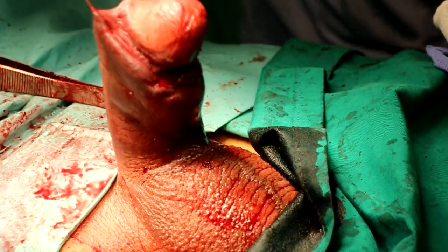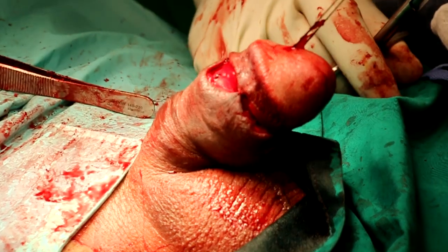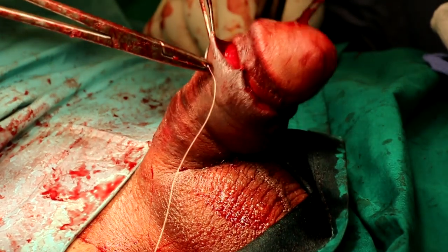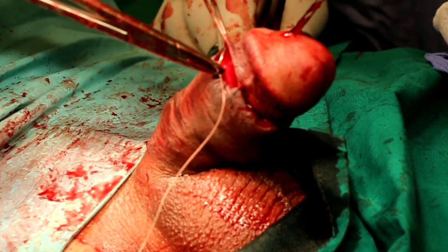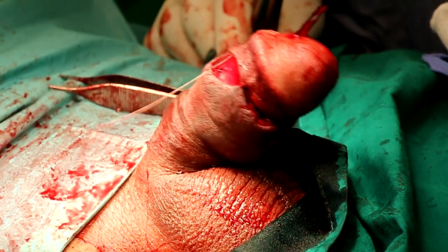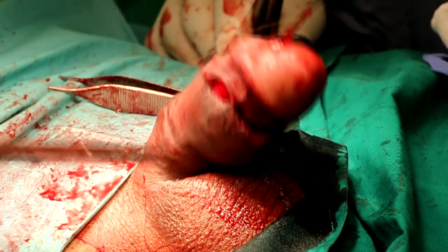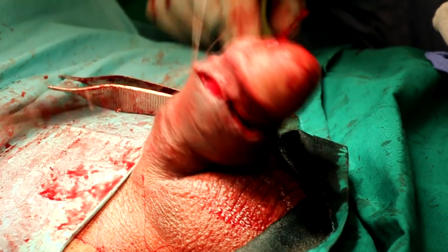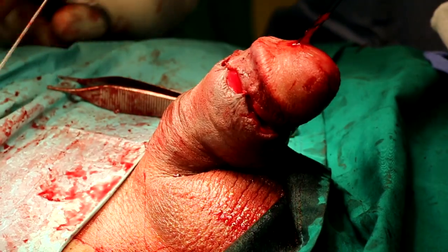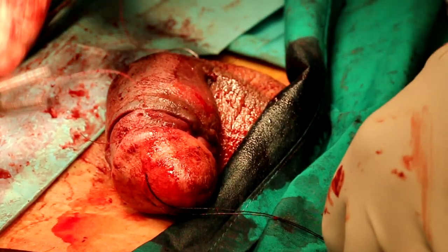This is for good adjustment of the edges. If you close all around, starting from, for example, 12 going clockwise or anticlockwise, the skin will be corrugated, and at the end you will find non-equal edges. So if you want to close the skin appropriately, use landmarks, and the sutures should be absorbable. Use chromic if you have it. If you don't have chromic, undyed Vicryl is also nice.